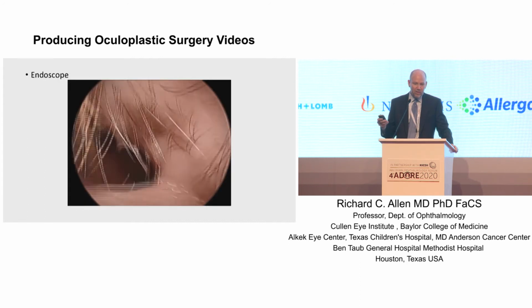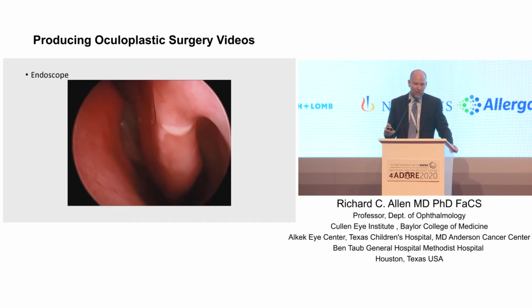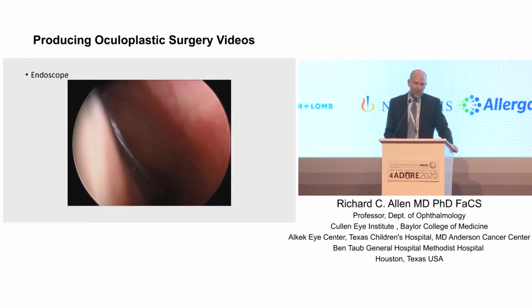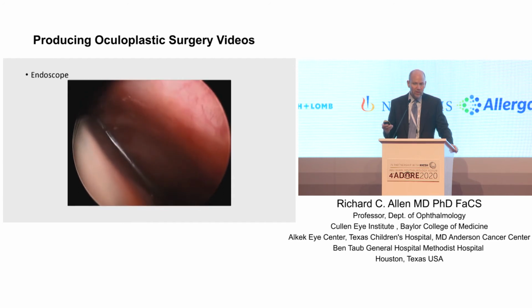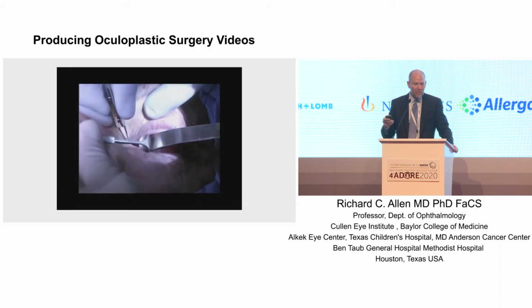The nice thing to do is to take the endoscope out and then demonstrate your intranasal anatomy. So we're just going under the inferior turbinate here, and that way we can visualize where the probe is coming out from under the inferior turbinate. So again, a combination of different systems to use in order to demonstrate the surgery that you want to demonstrate. And I'll actually skip that one.